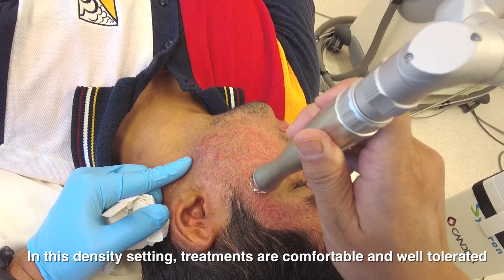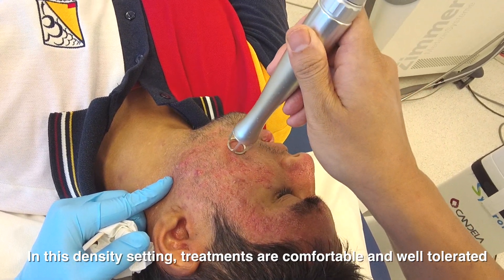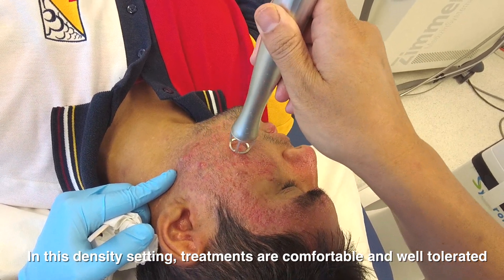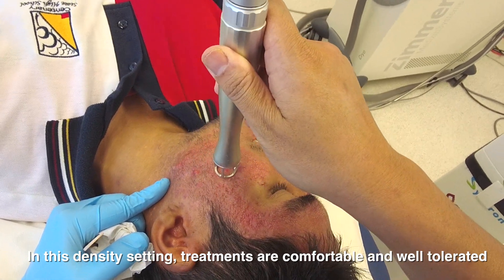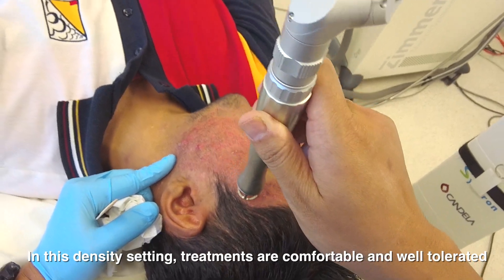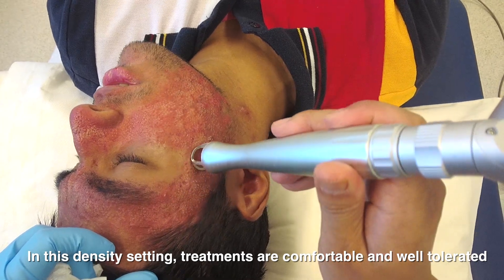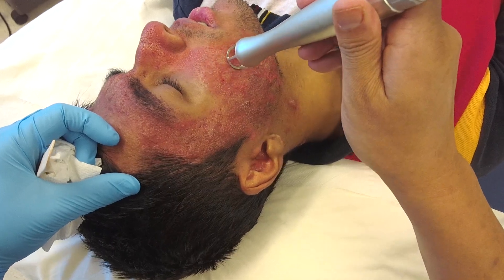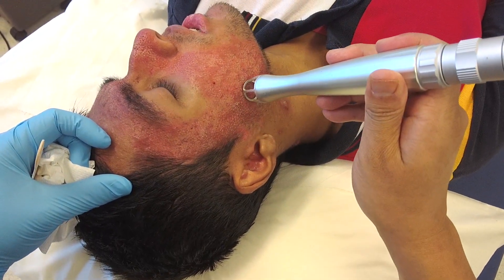The doctor counts through multiple laser passes over the treatment area, completing 20 passes on one section and 10 passes on another, systematically covering the scarred regions.